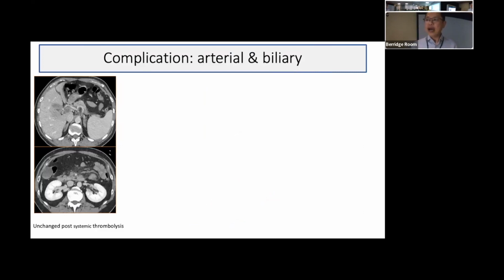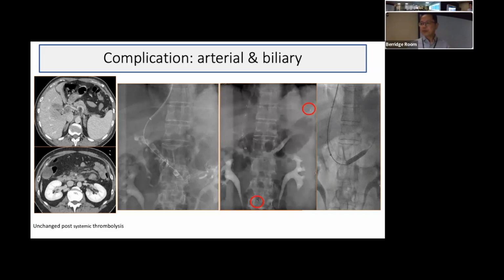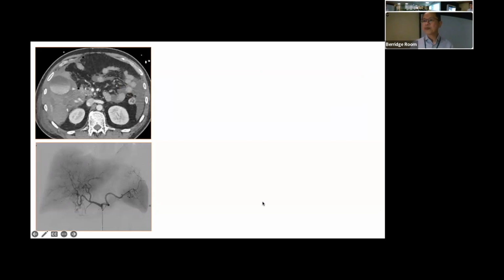So I have everything there, arterial, biliary, and so forth. This is a patient 50 years old, presented with acute and chronic portal vein thrombosis. You can see here, occluded vein here, and nothing in the SMV. I proceeded to do these TIPS, quite challenging, multiple punctures, almost wanted to give up, including transhepatic and various approaches to get in there. But finally, we got in there. I left two catheters via the sheath here. I deployed the stent, one in the splenic vein, and then the other in the SMV.